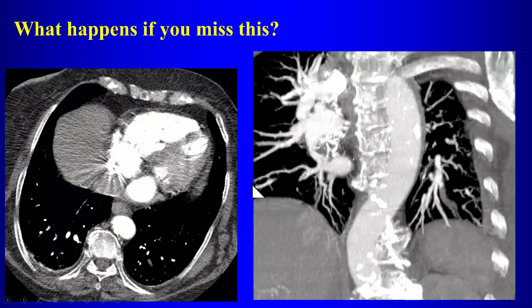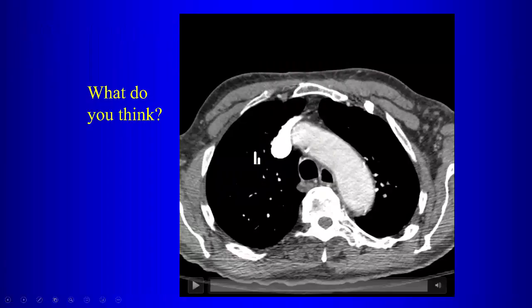Yeah, tending calls you over, but pretty much nothing. So it's actually controversial whether you need to treat a single subsegmental PE in a patient. That's why you don't want to miss the big central PEs, and you probably won't. Any kind of decent CT scan, you're going to be able to pick up the big central PEs, especially if there's any right heart strain.